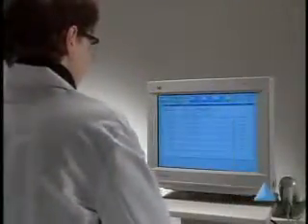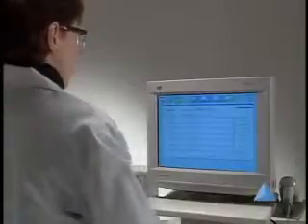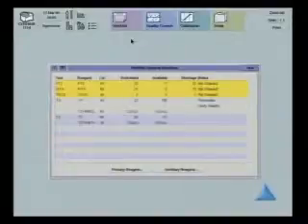Volumes of primary and ancillary reagents can be monitored using the Worklist Reagent Inventory window. To open the Reagent Inventory window, at the workspace, select Work List, and then select Reagent Inventory, or select Reagent Status and then Reagent Inventory.